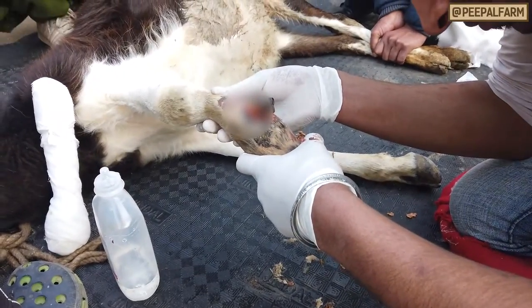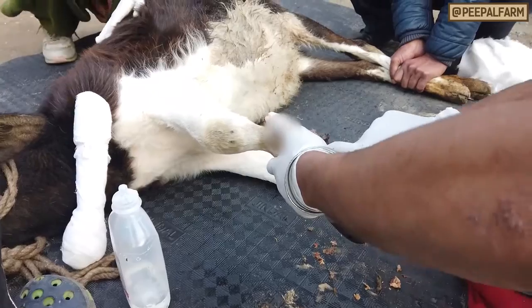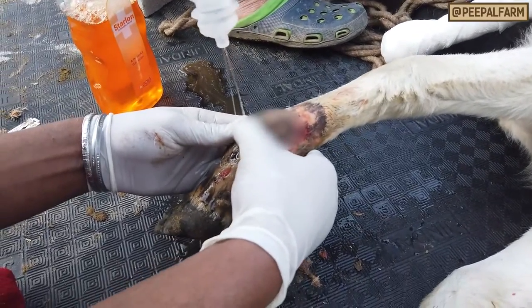Step 3: If the fracture is compound — meaning there's a wound and the bone is sticking out — clean the wound by flushing it with NS.